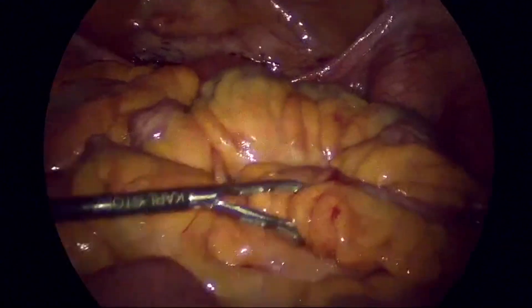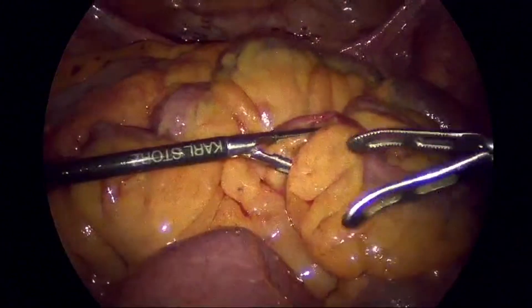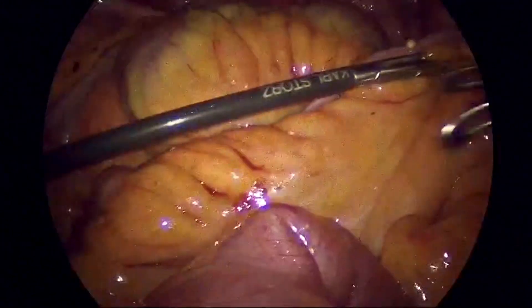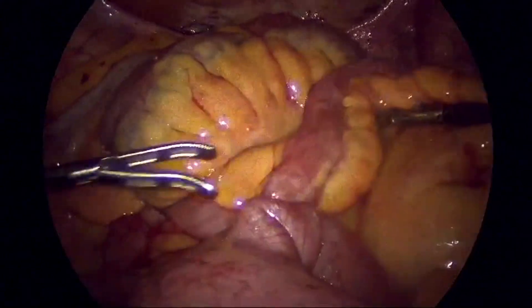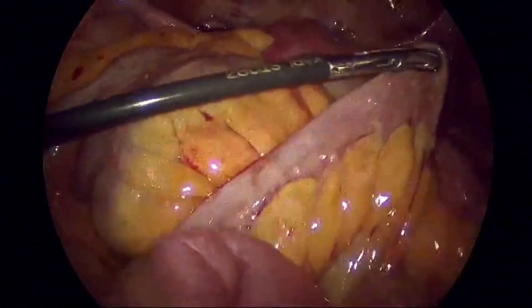A gentle bowel walk is being done and we were also trying to see if there is any stricture. We have not seen any stricture here and the bowel looks fine.